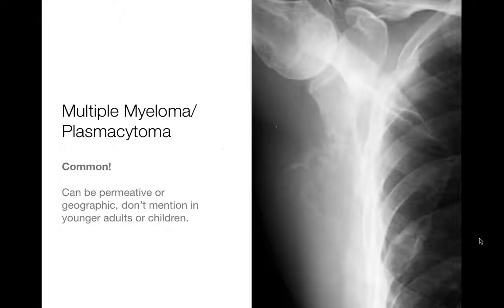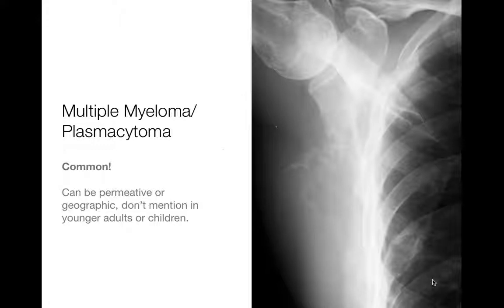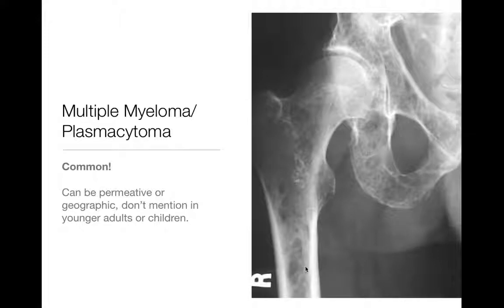Multiple myeloma and plasmacytoma — very common in older adults over 50. Please don't consider this in younger adults or kids. A solitary plasmacytoma, like in the scapula here, can occur as an expansile lytic lesion. If you look closely, there's another lesion in the rib — another focus of multiple myeloma. This is the more geographic appearance of plasmacytoma, versus the more permeated moth-eaten appearance of diffuse multiple myeloma seen throughout the femur and pelvis. Super common — please think of it in older adults.